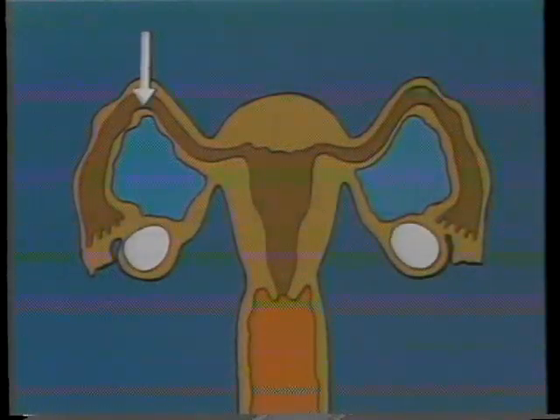The laparoscope has been inserted and the doctor is viewing and manipulating a tube. If you are having a sterilization procedure, the tubes will be closed at the location of the arrows.